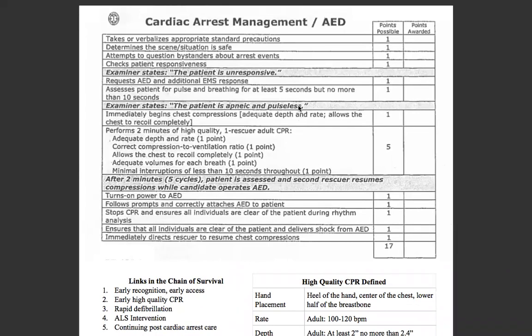We're going to start off every skill with standard precautions, scene safety, and we're going to attempt to question any bystanders about the arrest events — did you see what happened as we're walking up? Then we're going to check responsiveness using our AVPU acronym: tap and shout, sir, ma'am, wake up, open your eyes. No response, painful stimuli. If the patient is unresponsive to painful stimuli, as they are in this scenario, we're going to turn to our partner and request an AED and ALS.